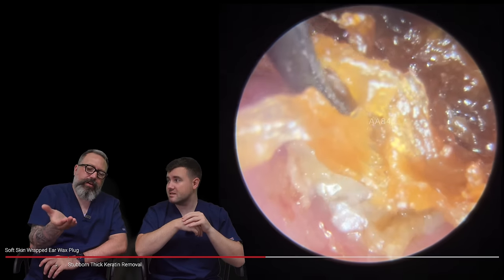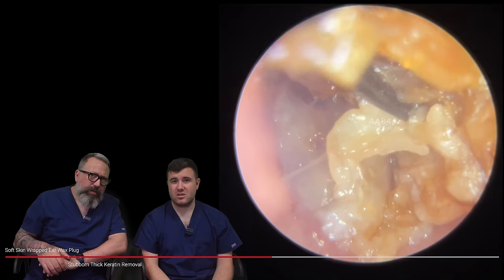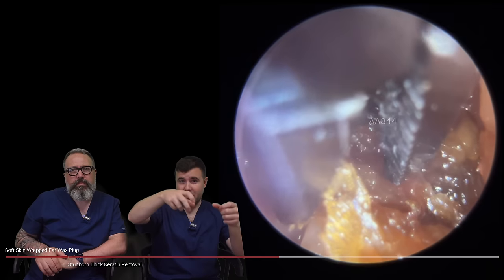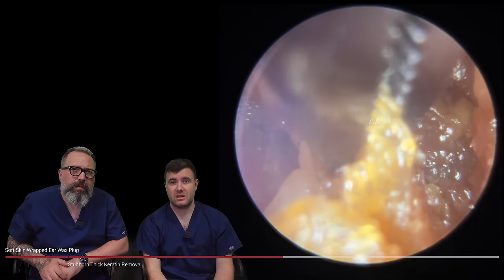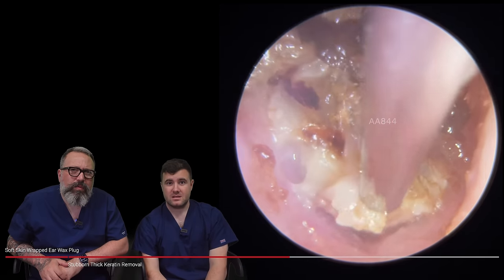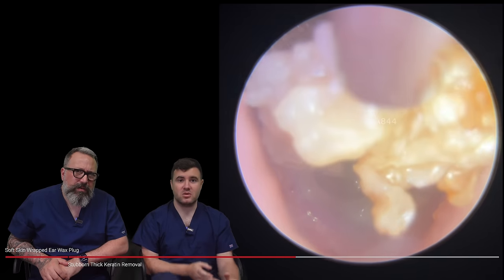I'm really really giving this a good lift. You can see the soft thick character under there — my goodness. I've angled the forceps differently, going in almost upside down. I'm doing this really slowly because of the position of this — I know it's really firmly attached to where the eardrum is. It's just broken a little piece away. You can see how tightly compact this has been right against the eardrum. This is not going to look pretty when it comes away — this is not going to be your textbook eardrum.